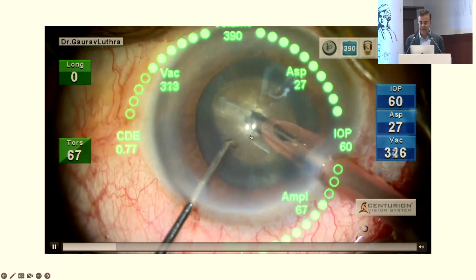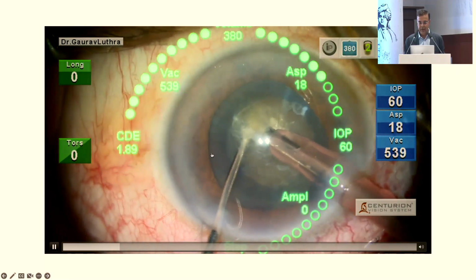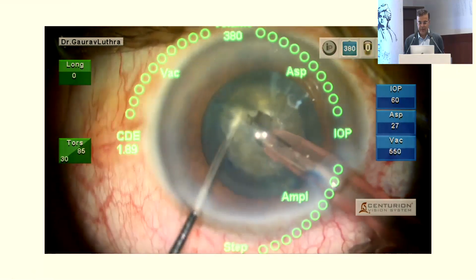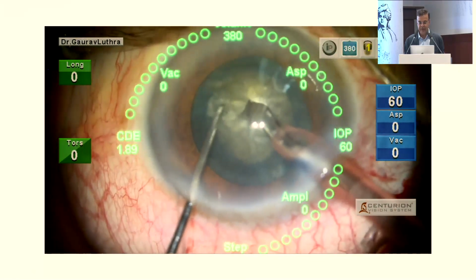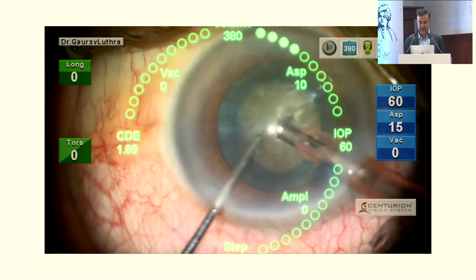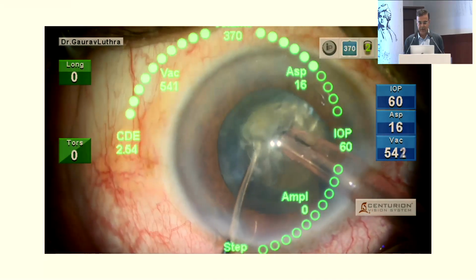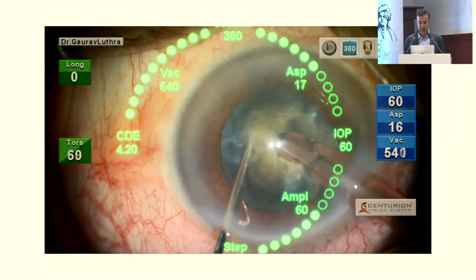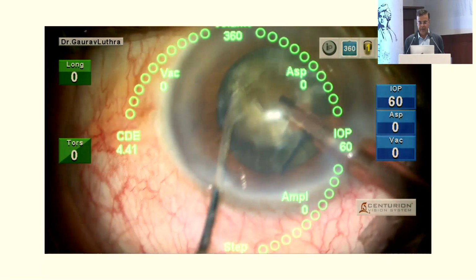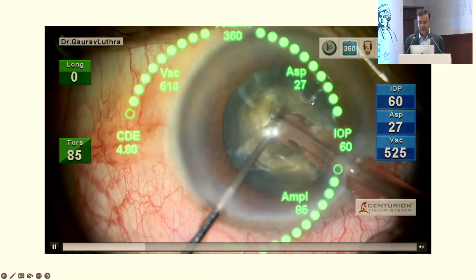Now I proceed with surgery, and everything is going great for this time, but there's a lot of lateral separation required. My rhexis is not big enough. It should have been another millimeter or two bigger. So you'll notice that as I'm going through my cracks, the rhexis breaks from that point where I had that small fibrotic thing.